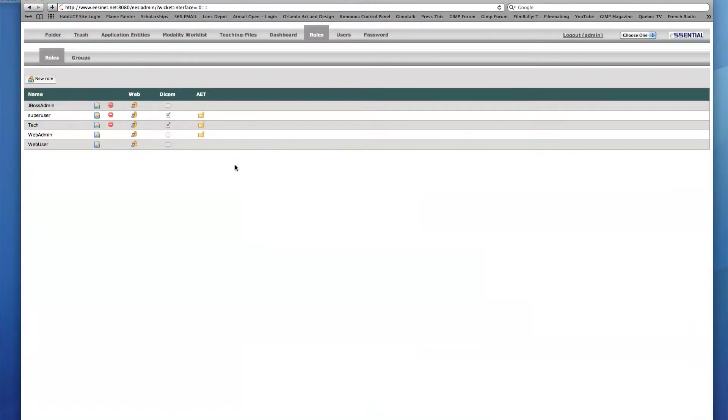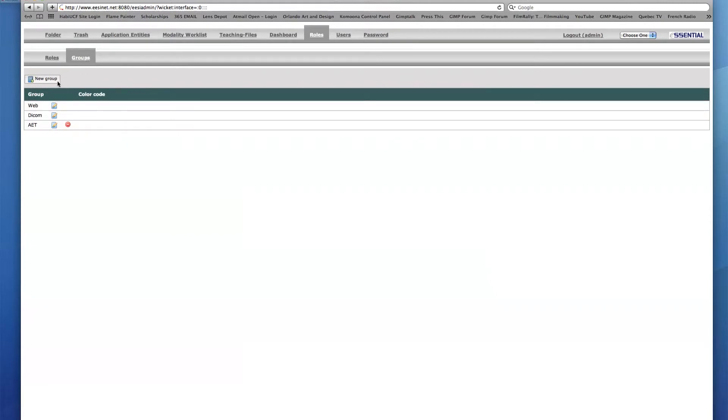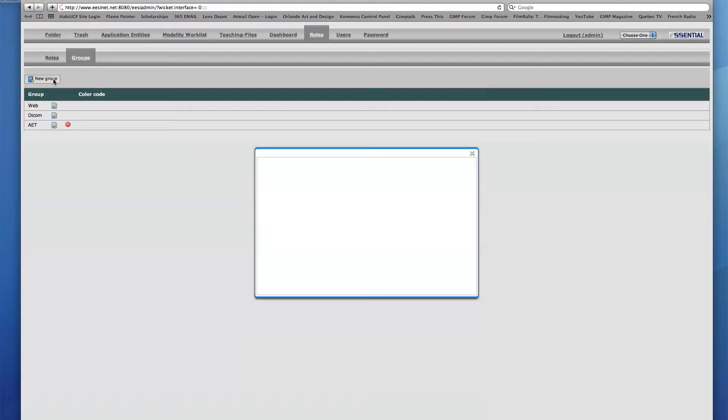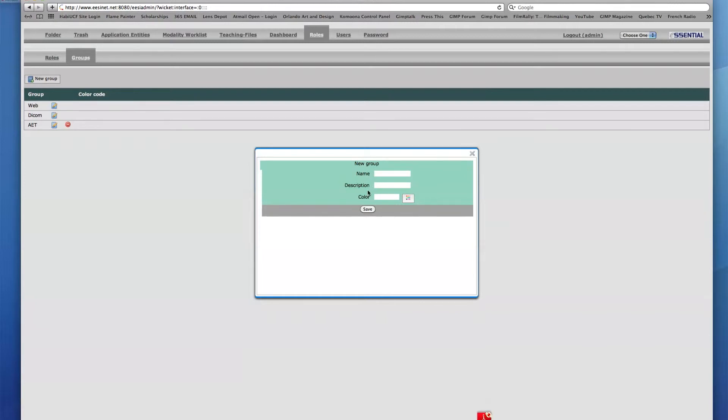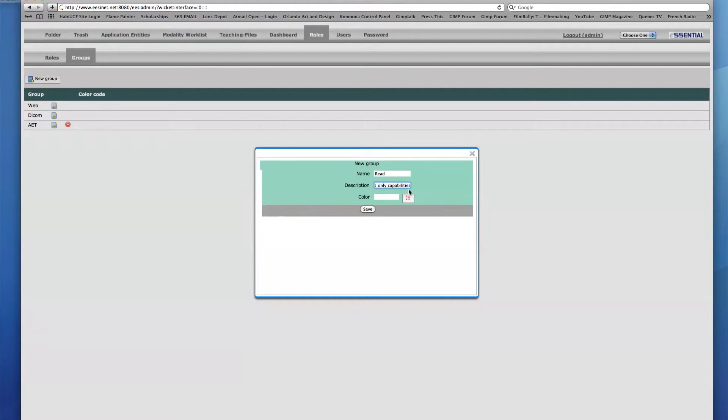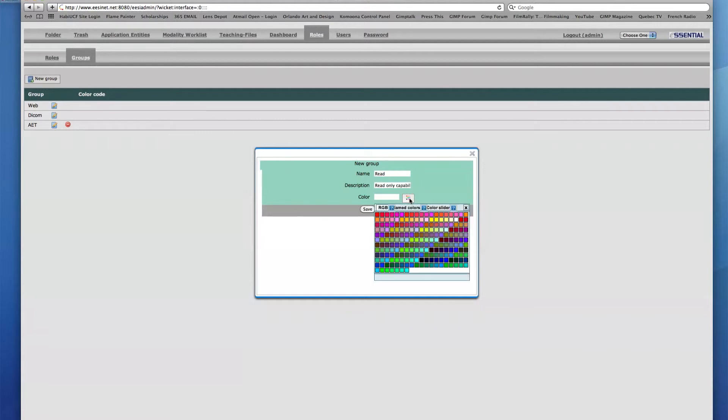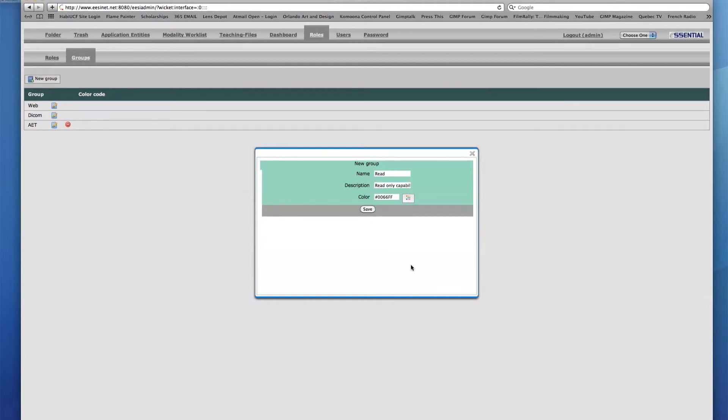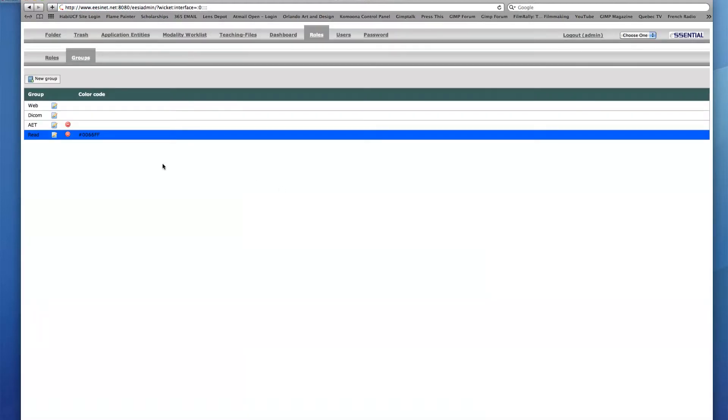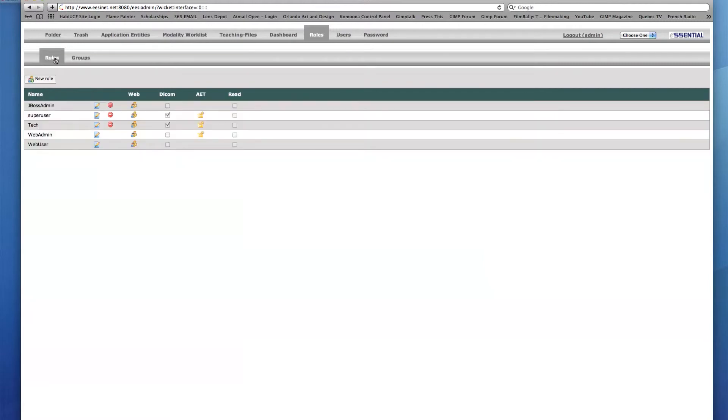New role groups can be added in the Groups sub-tab by clicking the New Group icon. Groups can have a custom name and description along with a color code. This makes it easier to distinguish different groups from one another within each role. For example, I'll create a group called Read for all roles with read-only capabilities and will assign it a blue color. If the role has the Read checkbox enabled, it will now have the blue color checkbox area in its row.